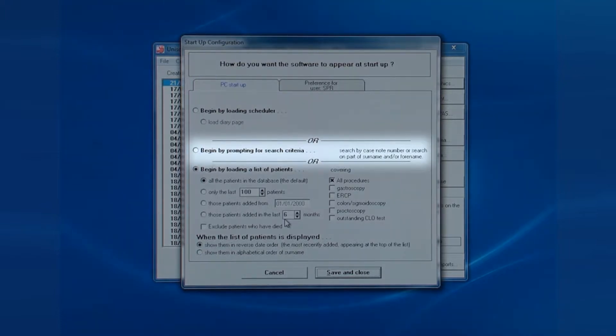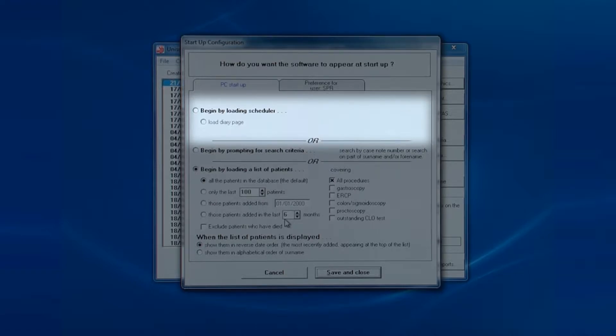If you have the scheduler enabled, you will see this option. You can automatically have the diary page for today being displayed for endoscopists to work off their work list.